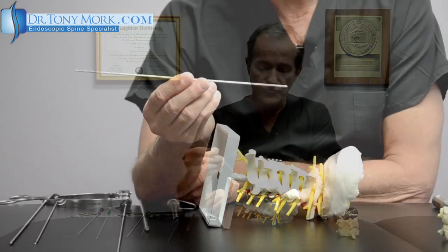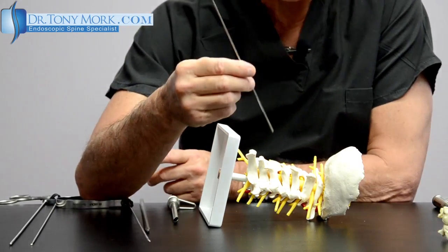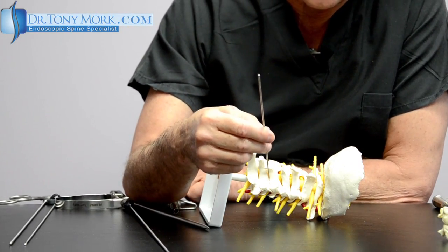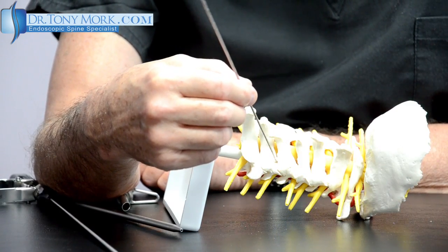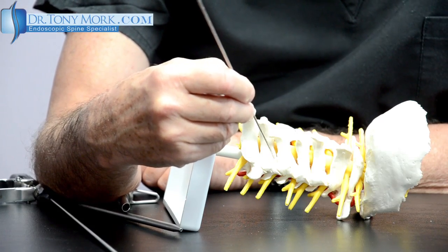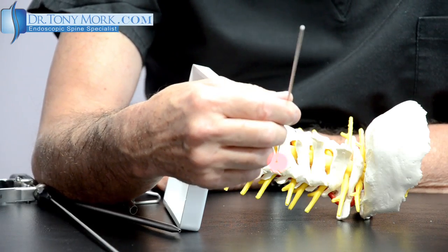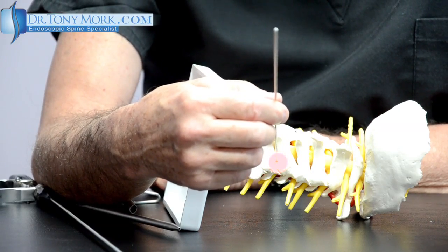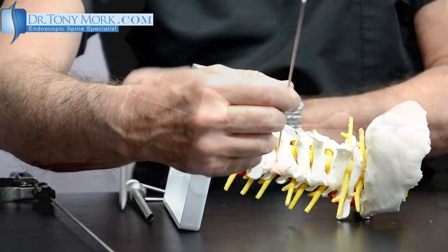The first thing done for a cervical foraminoplasty utilizing a five millimeter scope is the following. We utilize a small guide pin like this to establish where the facet joint of interest is. For example, in this case at the 5-6 facet level, the area I'm interested in relieving or removing is highlighted in red here. This pin goes right on top of the area of interest, and on top of that is followed by a cannula.